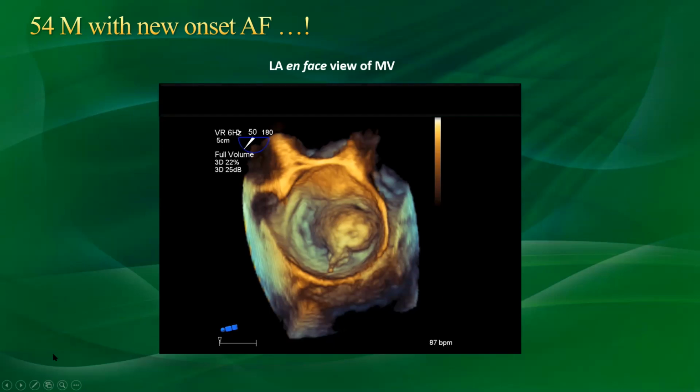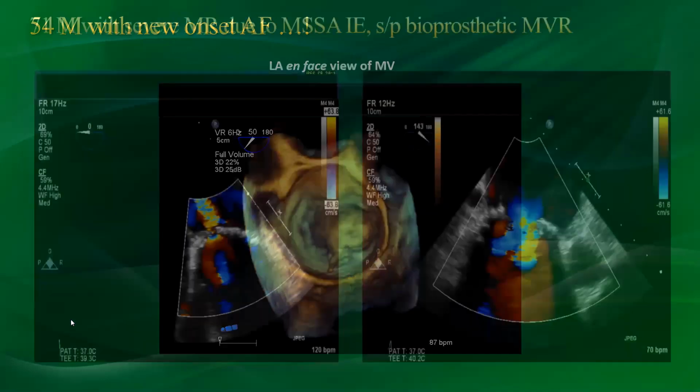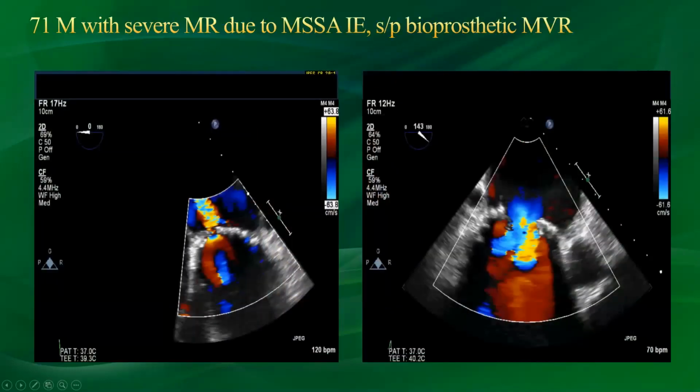It makes sense. It's the same example I showed you with the mitral cleft. Some things you cannot see with 2D, but you can easily appreciate with 3D echocardiography. This was one of the first cases I saw after I graduated from my fellowship at Creighton. So it's an interesting case for me. Now, let me give you another example, and we'll talk more about 3D color here.